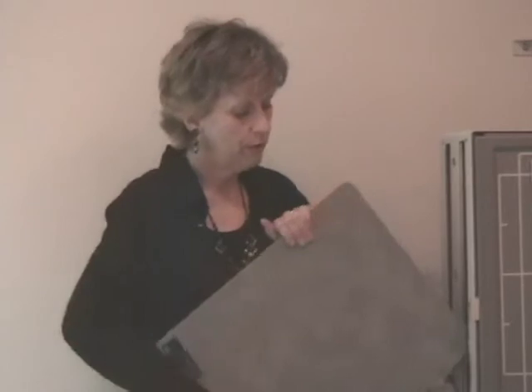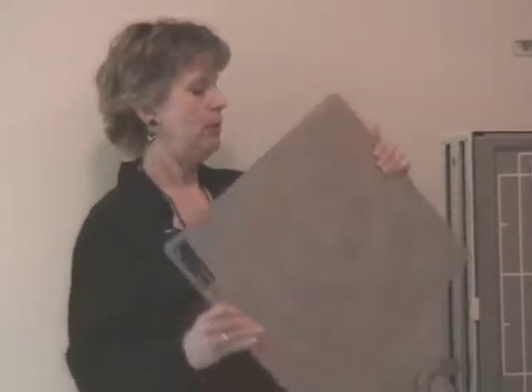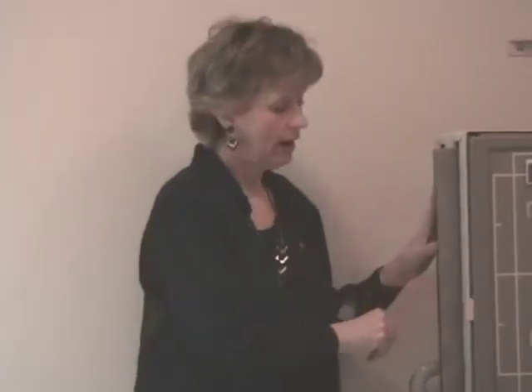Go ahead and keep the film lengthwise with the ID to the top, knowing that the lung fields are actually smaller because of the obesity issue. That's one reason obesity is not healthy for you, because it will compress the organs and they can't operate to their most efficient method. We're not talking about stretcher chest today or portable work.